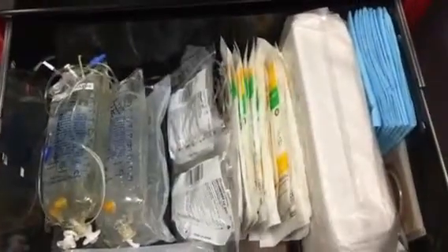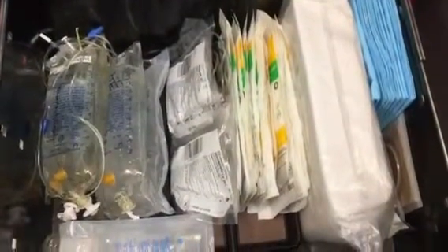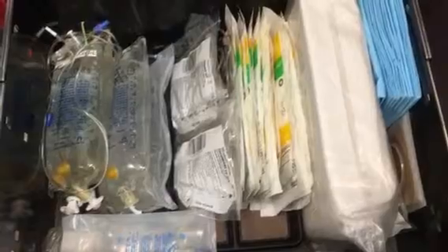Your last drawer is miscellaneous. There are sterile gloves, you have your IV starting kits, your bags of fluids, there are chucks, and a Foley tray. Depends on the case. Each simulation we may add more equipment. So if you're not able to find it in the drawer, usually we will put a table on the outside for you as well.